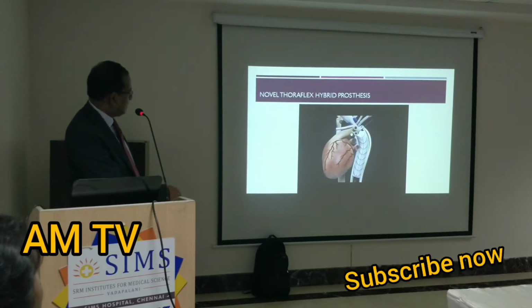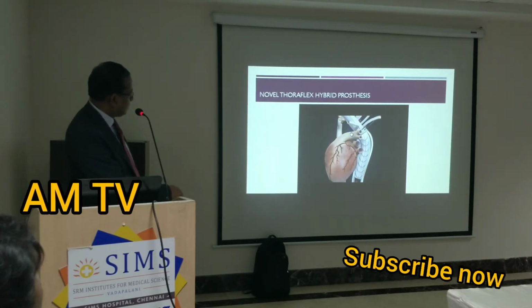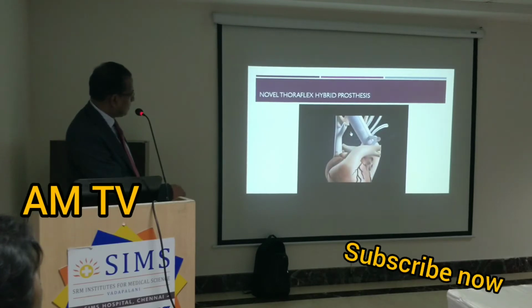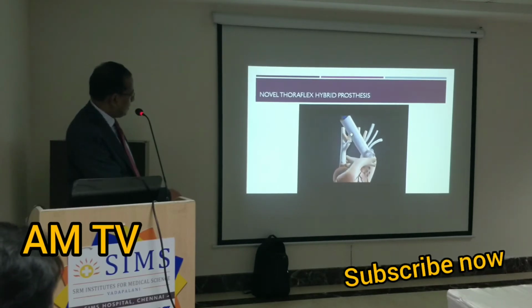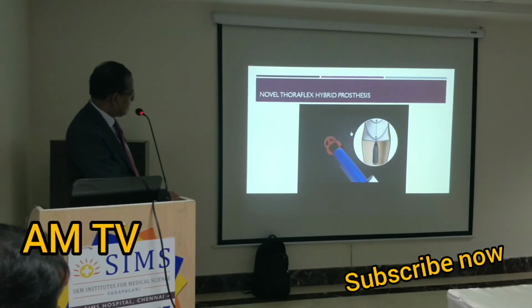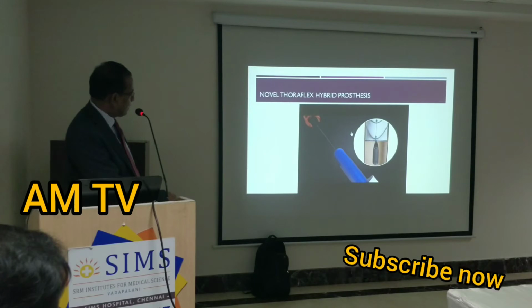we replace the arch of the aorta. You can see the branches of the graft which supply, this goes to the left side of the left hand, this goes to the brain, and now the end of the graft will connect to the heart. That is how it looks once it is removed.